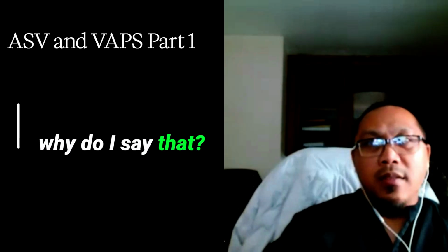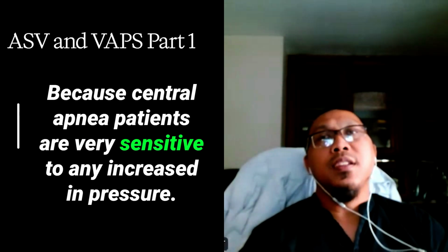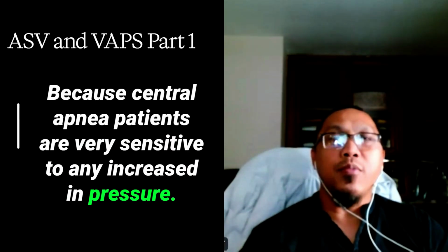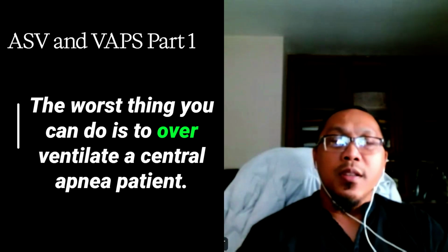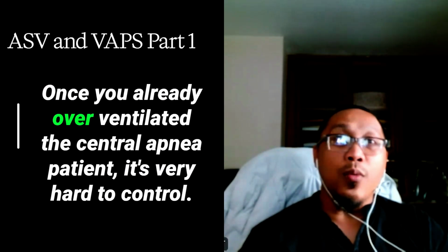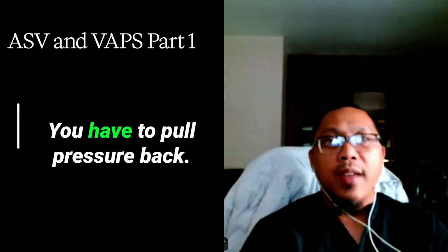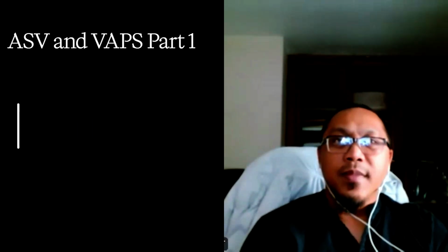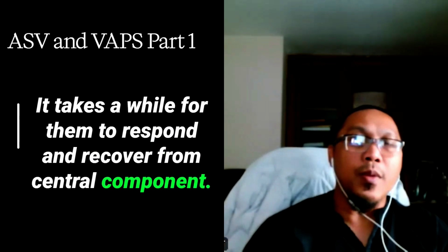Why do I say that? Because central apnea patients are very sensitive to any increase in pressure. The worst thing you can do is to over-ventilate a central apnea patient. Once you already over-ventilate the central apnea patient, it's very hard to control. You have to pull pressure back. And it takes a while for them to respond and recover from the central component.